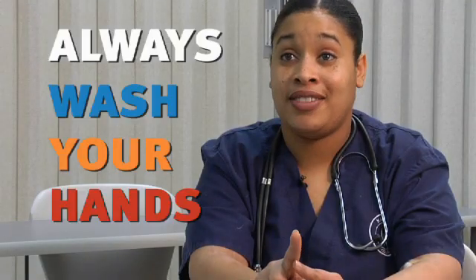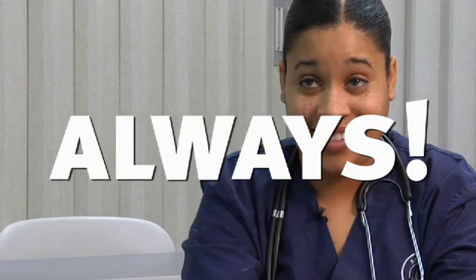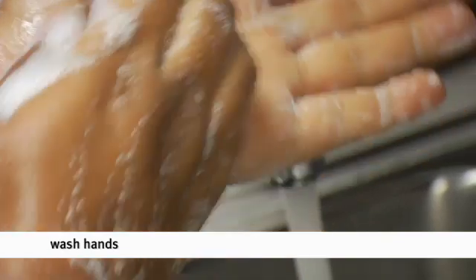First of all, you need your patient. I like to address the patient by their last name because it's more professional, unless you've gained that rapport with that patient. Always wash your hands — always. You have to make sure that you wash your hands thoroughly with warm water and soap to help prevent contamination.